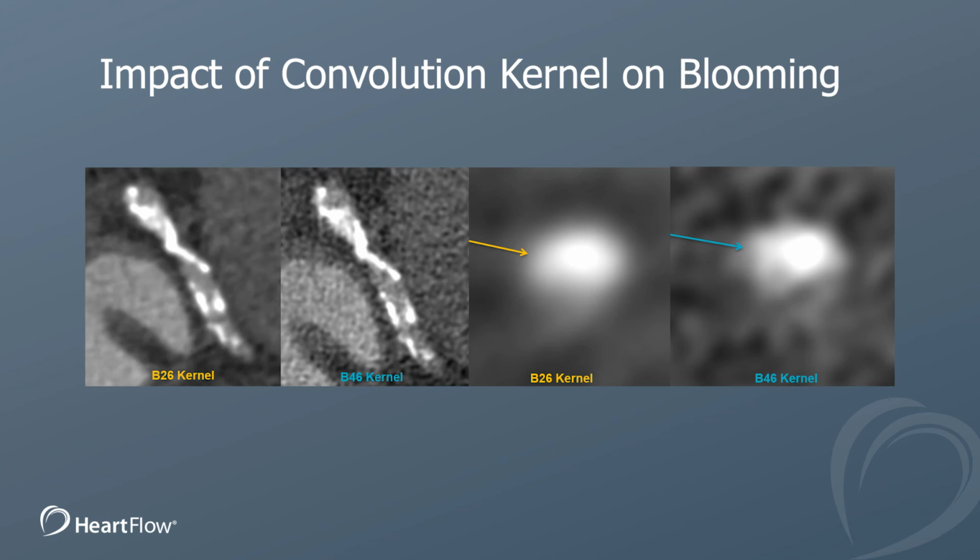Here's an image of a patient with a dense calcific nodule in the coronary, and when you identify these, in addition to your standard reconstructions, it may be helpful to make some sharper kernel reconstruction, higher resolution images, so that we can have a more accurate depiction of the lumen.